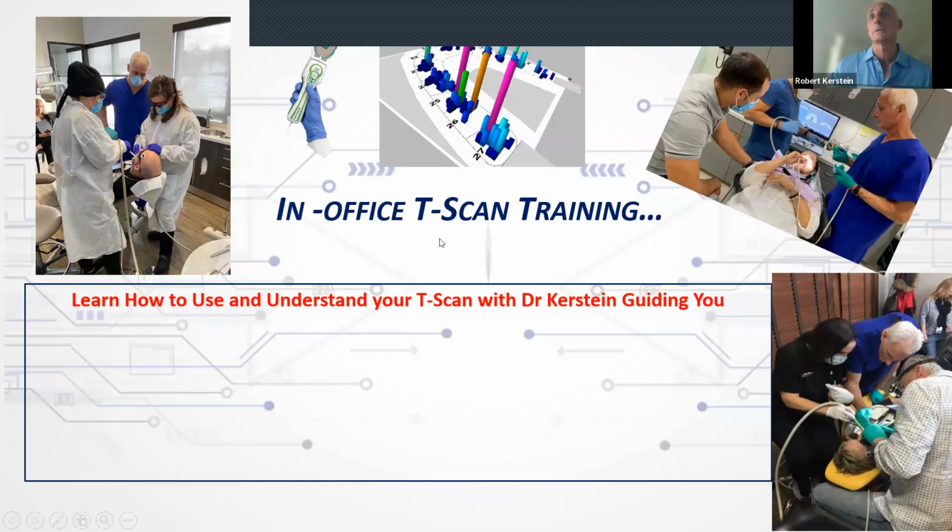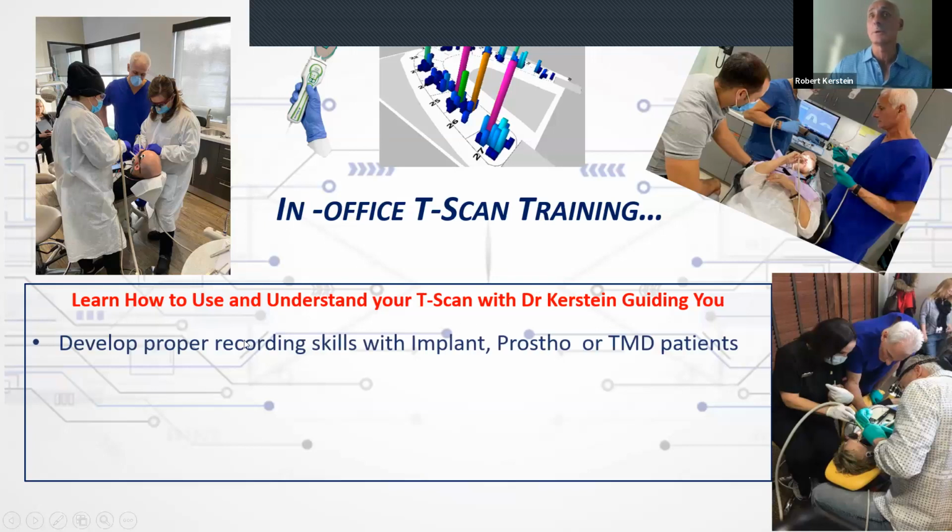The other thing that's very important to pass on to you is, if you really want to learn the TScan, your best and fastest way to speed up the learning curve is in-office chairside training with patients, with me guiding you. This is where you develop real good recording skills. You can see implant patients, prosthodontic patients, TMD patients, overdentures, splints, it doesn't really matter. You're going to learn how to use your TScan in any scenario that would be in your practice.